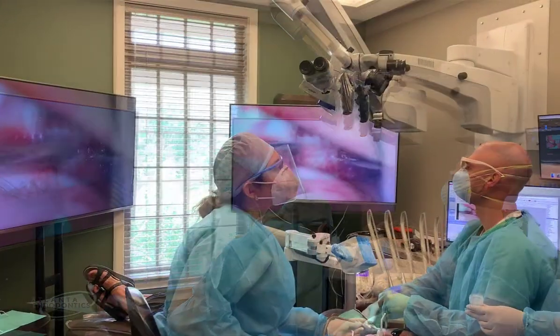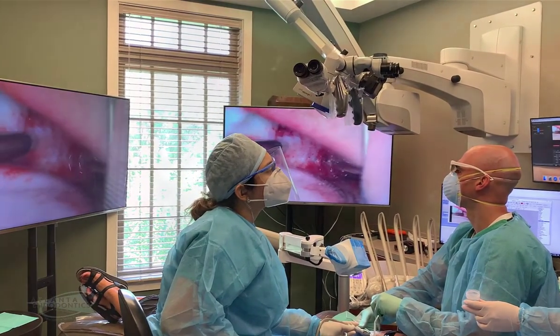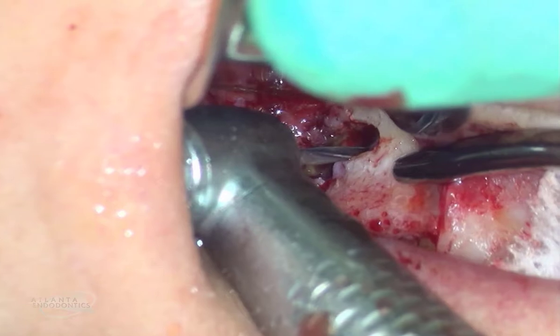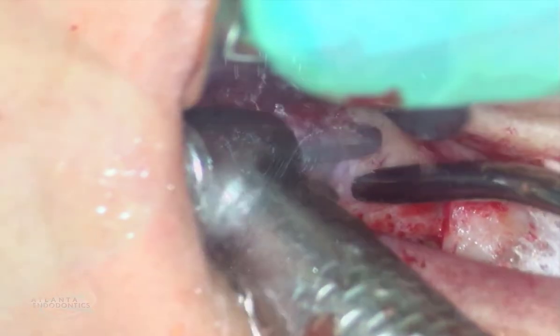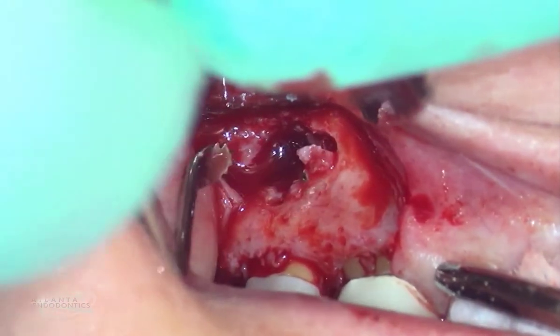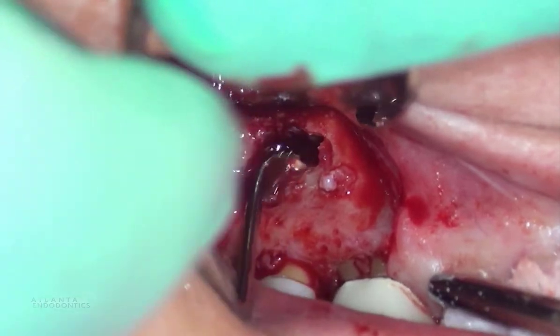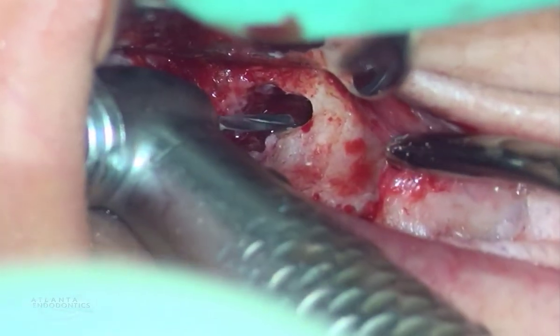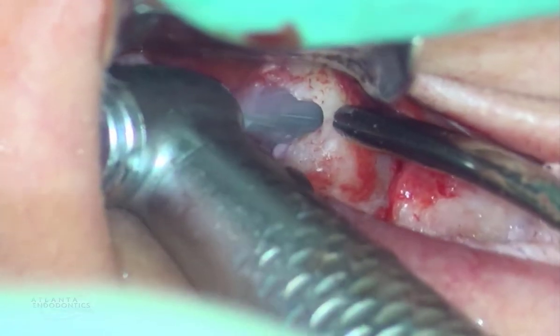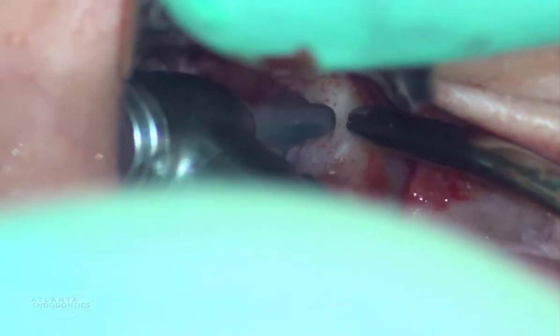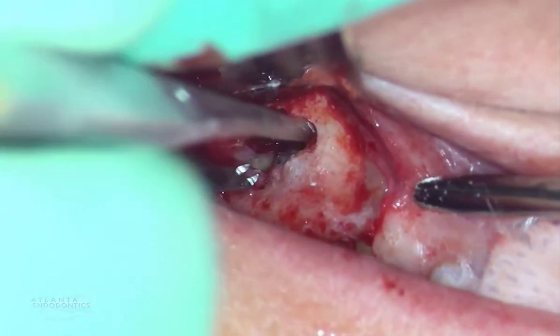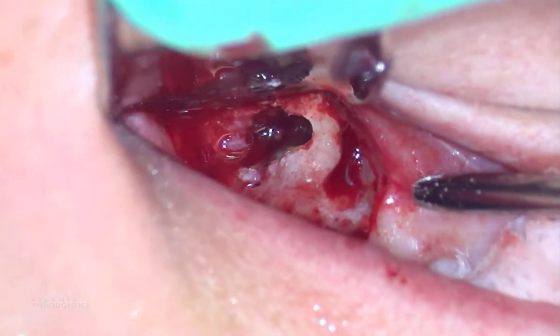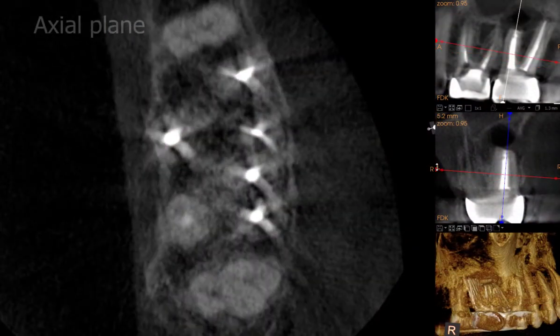The apical surgery was performed under a Moravision unit with root end resection and retro preparation of the mesial buccal root. Root end resection was performed with a high-speed handpiece. Curettage of the granulation tissue was sent for biopsy. The root end was smoothened with a high-speed handpiece in preparation for retrofilling. A portion of the mesial buccal root end was also sent for biopsy.